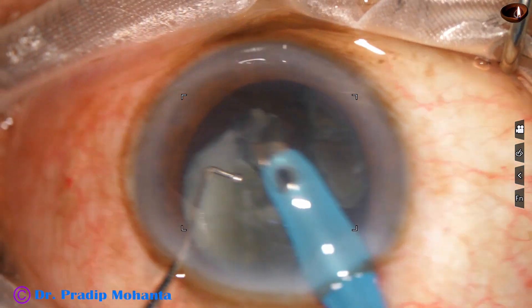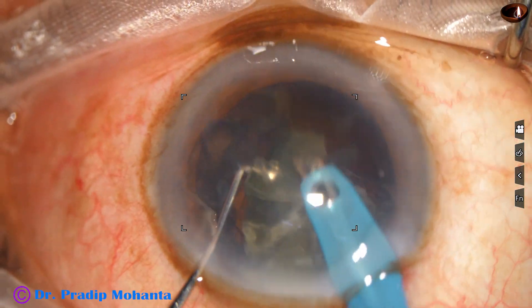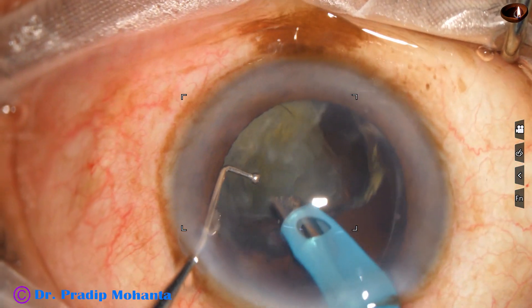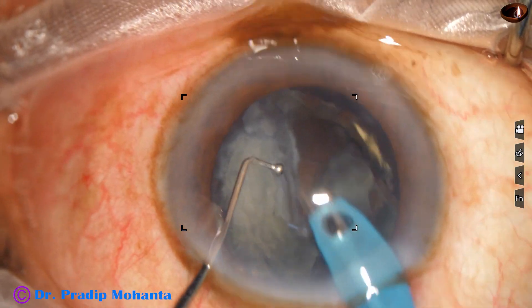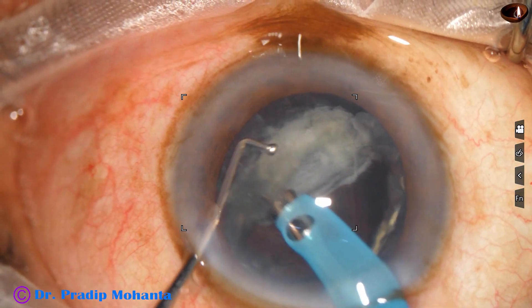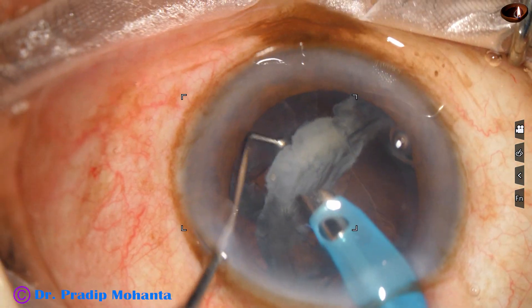It is a ball-tipped, round-bodied chopper. The length varies from 1.5 to 2 millimeters — whatever length you are comfortable with — but it should not be less than 1.5 millimeters, because you have to hook the equator and perform a horizontal kind of chop.